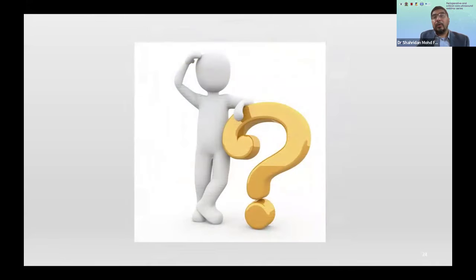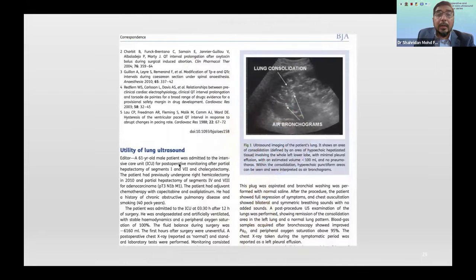Okay, coming back again. So how am I going to pitch this? I think I'm probably going to do this talk as a quick overview, mainly targeting beginners or novices for lung ultrasound. And after that 2011 anesthesiology article, the case series of 2 pneumothorax, BJA published this as a letter to the editor in 2012. And this was the lung consolidation with air bronchogram documented in this letter to the editor.